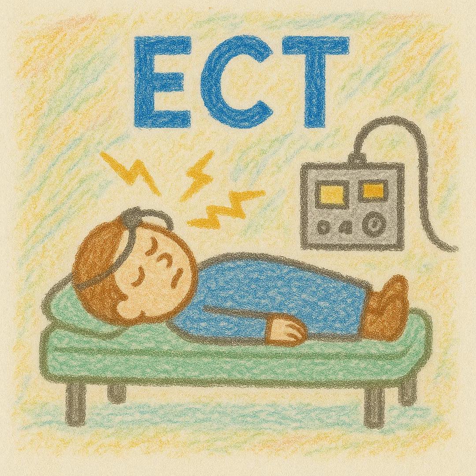For subsequent treatments, you're going to treat at a multiple of that seizure threshold. For a bilateral treatment, particularly bitemporal treatments, generally the effective dose is going to be 1.5 to 2.5 times the seizure threshold. So, just to make the math easier, if the seizure threshold is 100 millicoulombs, you're going to treat at 150 to 250 millicoulombs for subsequent treatments.